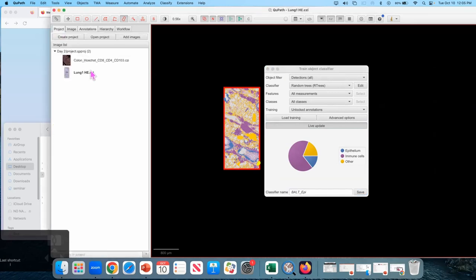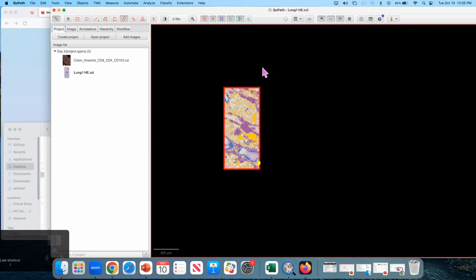Next up, so this is saved. Make sure you save it. It's actually gonna come up later, so really make sure you save it. Does it say specific to this project for what that does? Specific to this project. So if you look in the project, there'll be a classifier in some folder. You could drag that into another project. So if you have a classifier from one project.